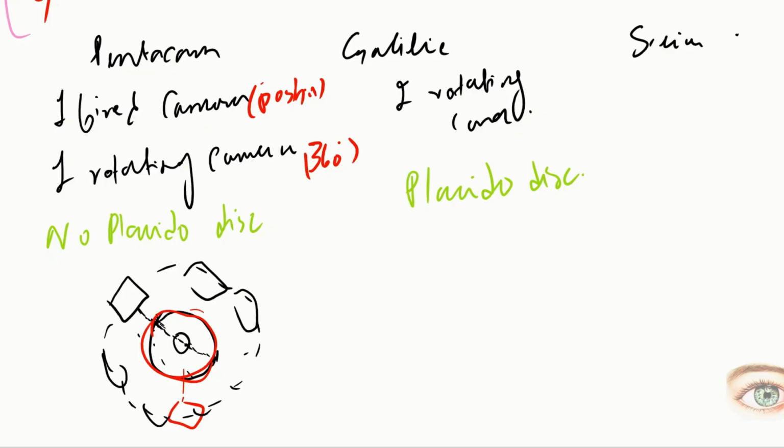In the Sirius, we have a Placido disc and a rotating camera. In research, almost always Pentacam and Galilei scan are compared, and their values are almost always similar, though corneal astigmatism has been given very accurately by Pentacam, though the Galilei scan gives very accurate simulated K values.